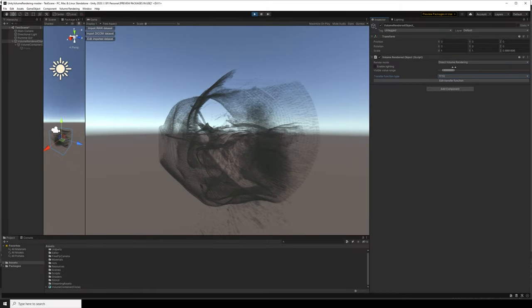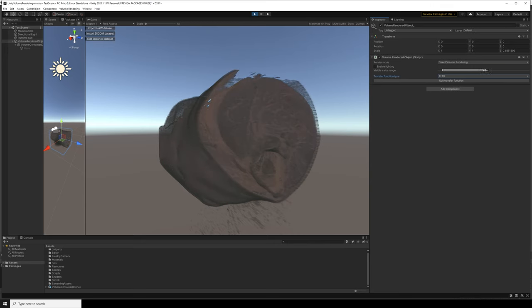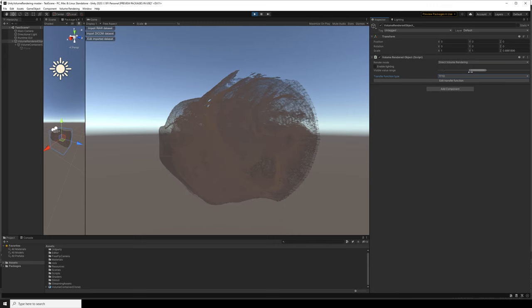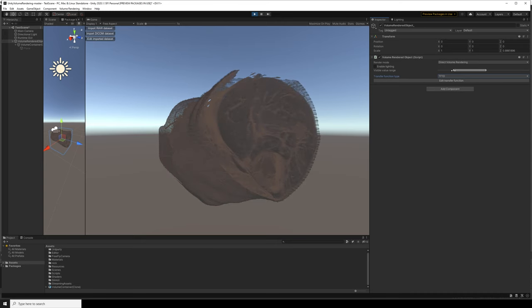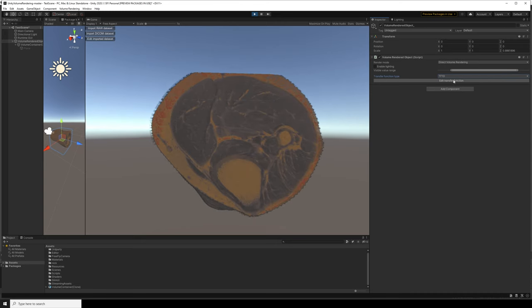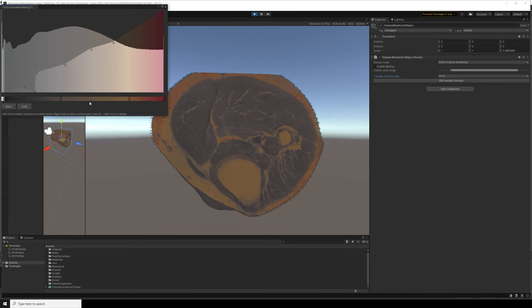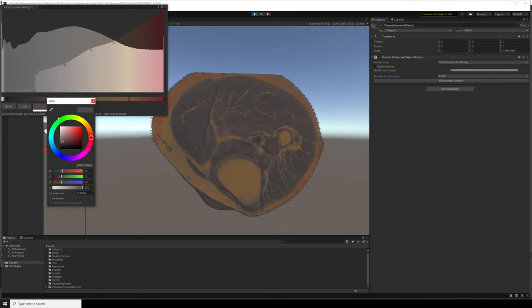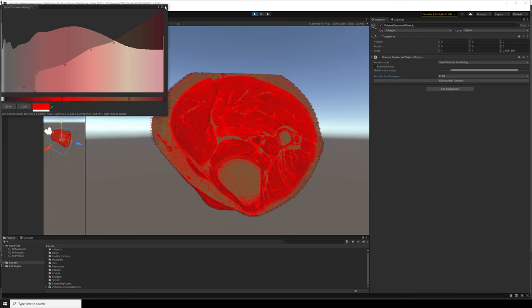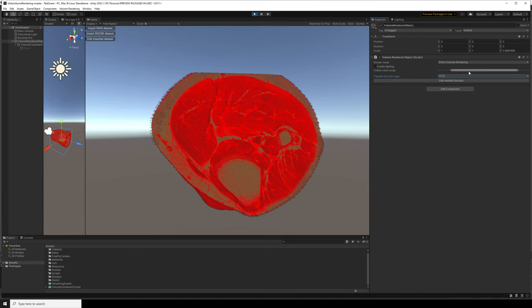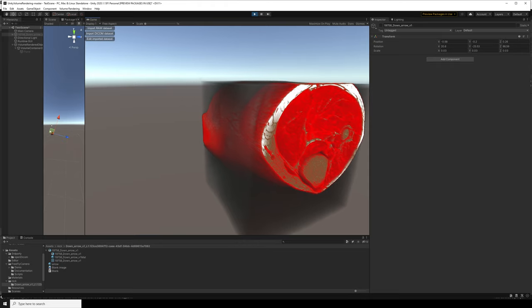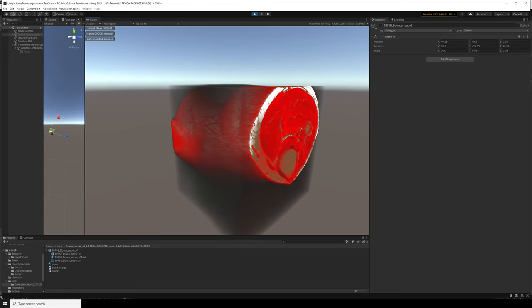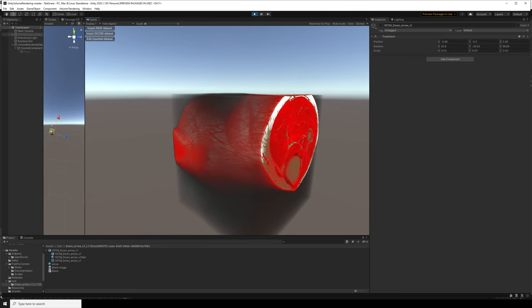So I'm going to head over to Unity here. We're just going to load up those DICOM files into a 3D model. This is completely separate from the 3D Slicer file, but we can combine the two later on. I'm just going to play around with a couple of different settings, change the views. As you can see, you can edit the transfer function here. One big difference is that this is going to get rendered directly off of the imaging, where our 3D Slicer relies on manual tracing.